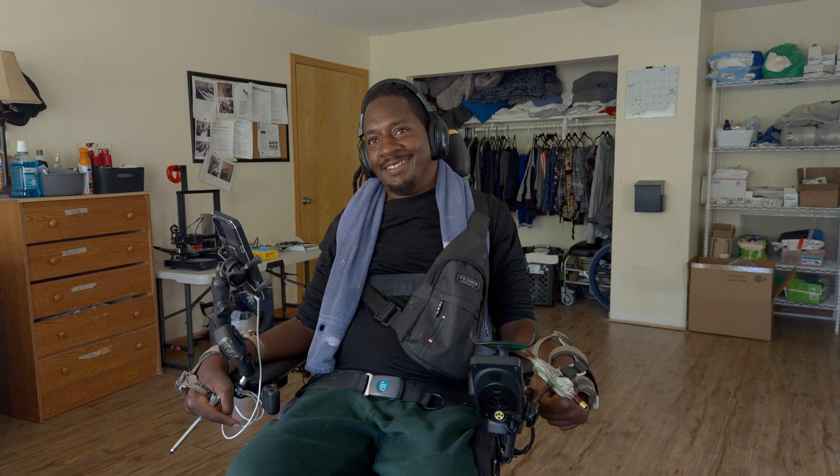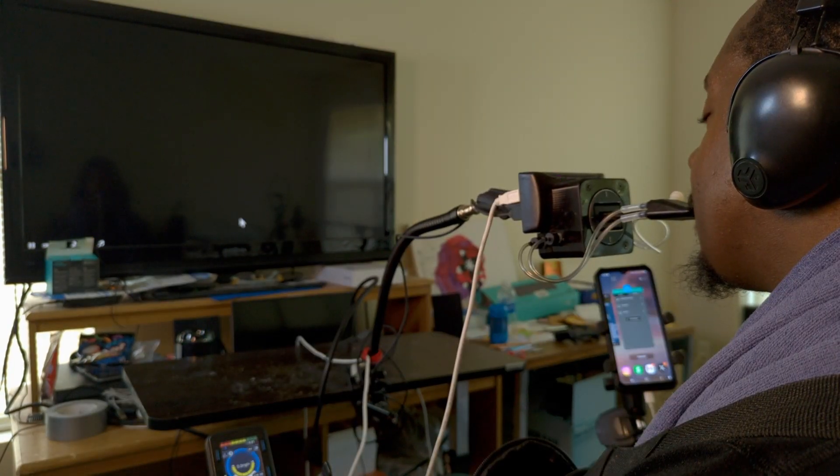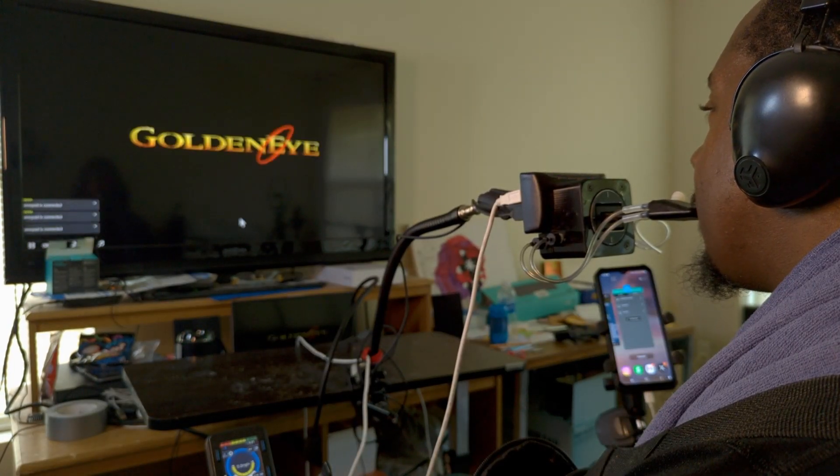Now that you've met Rashad, a gamer with a spinal cord injury, let's learn about his adapted gaming setup. Rashad built a gaming PC designed to run video game emulators so he can play all of his favorite retro games.